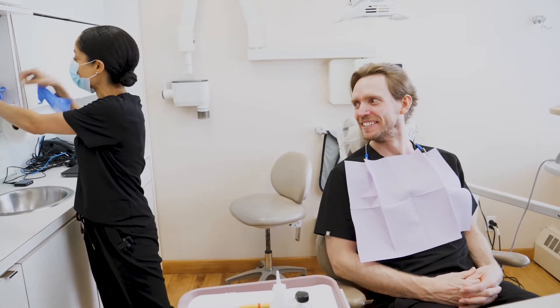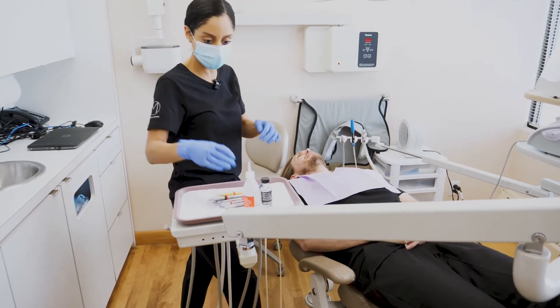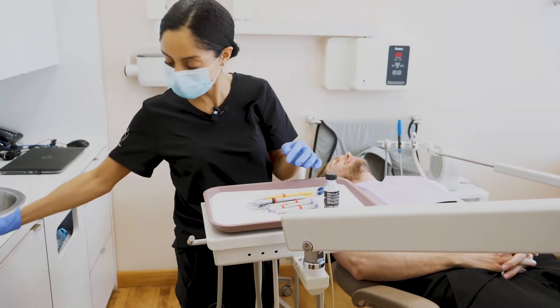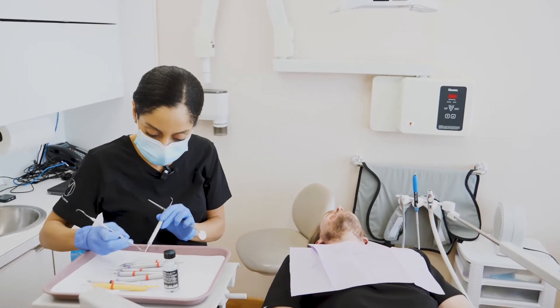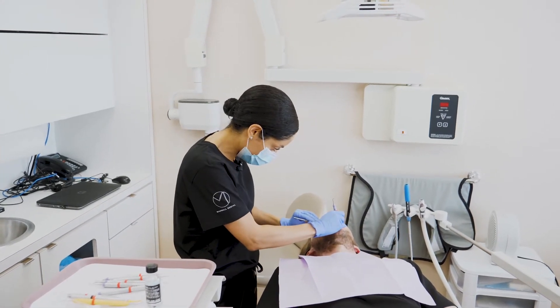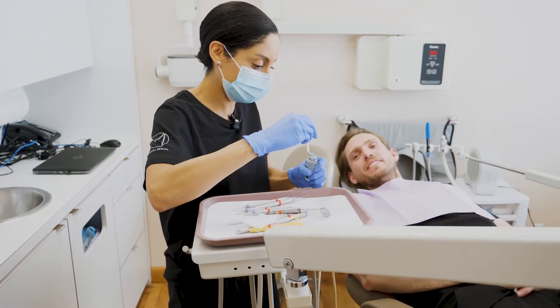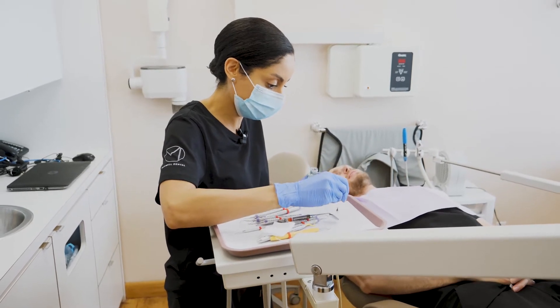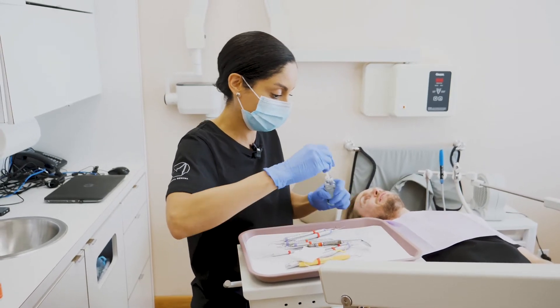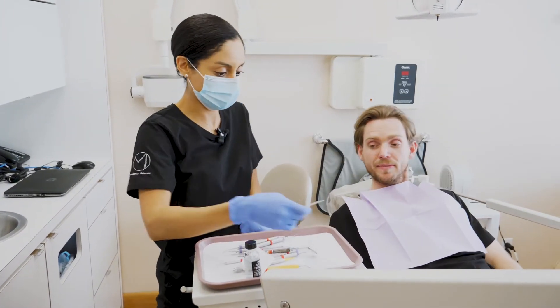I'm just going to sit you back and bring your chair up. I'm going to put your plaque into this liquid on this little sample here so that we can see it, and put it on my little microscope slide — doing the same thing in each quadrant of your mouth. I'm just going to cover up your sample with a little slide cover. The bacteria we're going to be looking at today are anaerobic, meaning they can't survive in oxygen. So we're sealing off the edges of the slide so that they stay alive long enough for us to have a look at them.